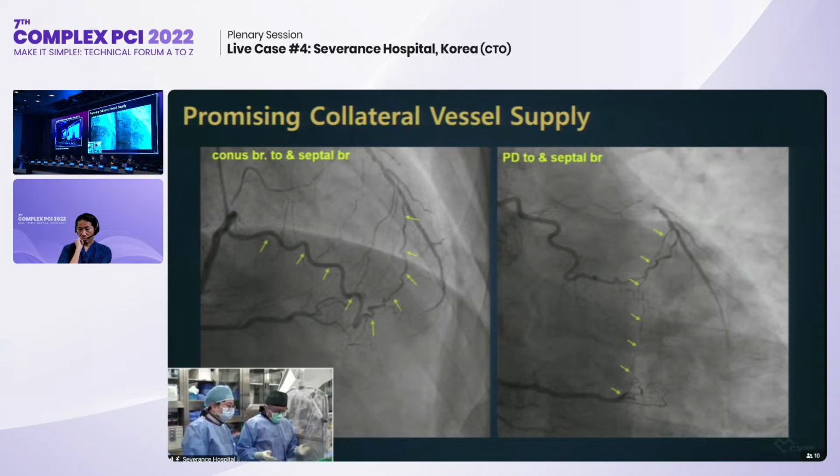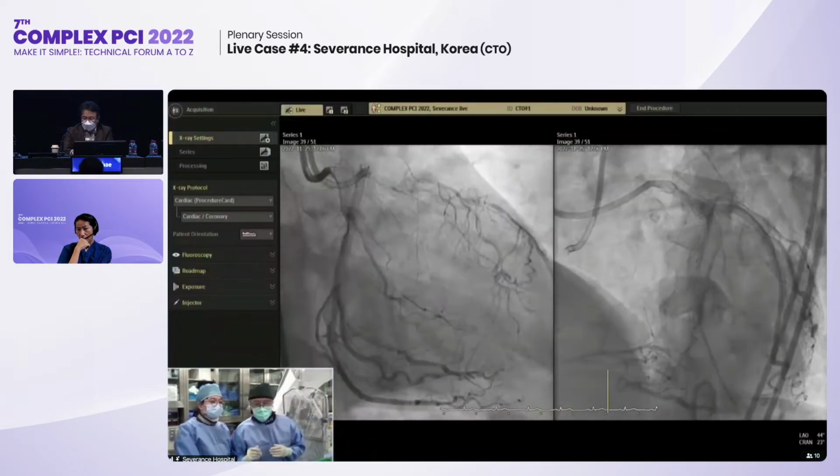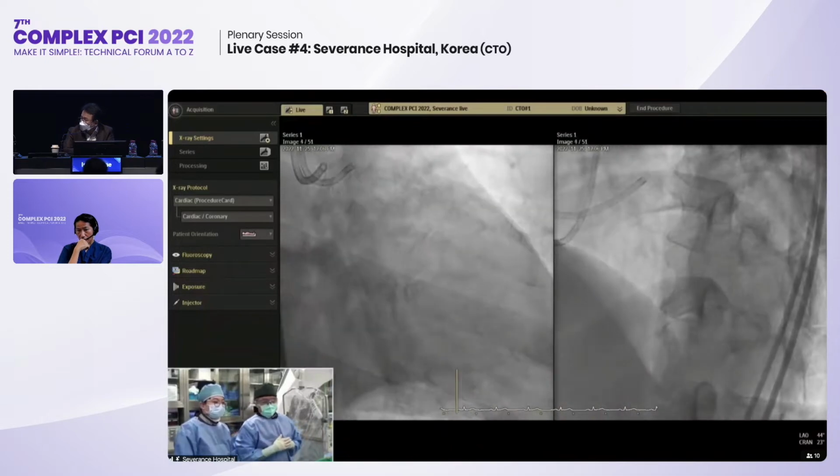Is there any comment or question about our case? I think there are a lot of issues in this patient, and we have a great panel here. Are there any comments from the panelists?